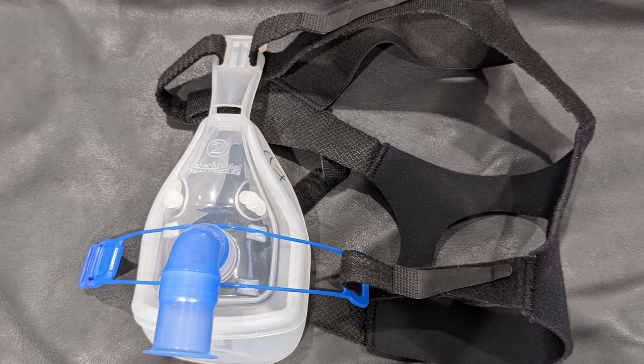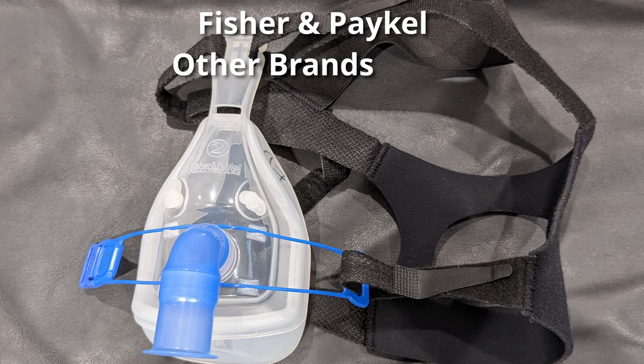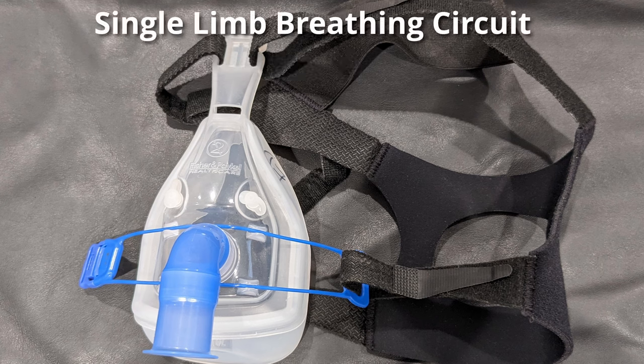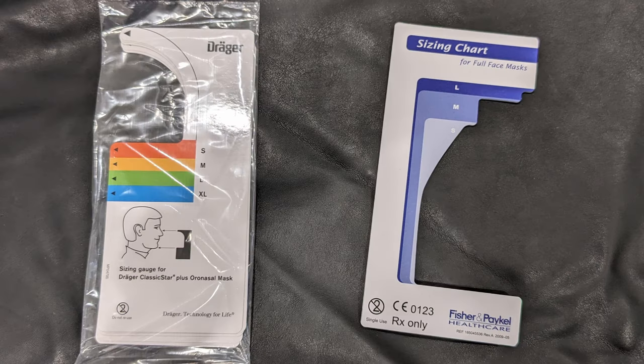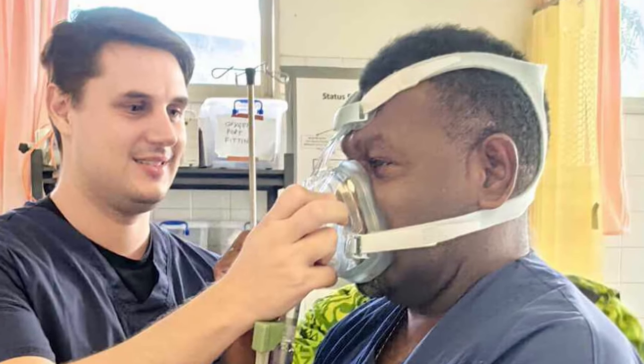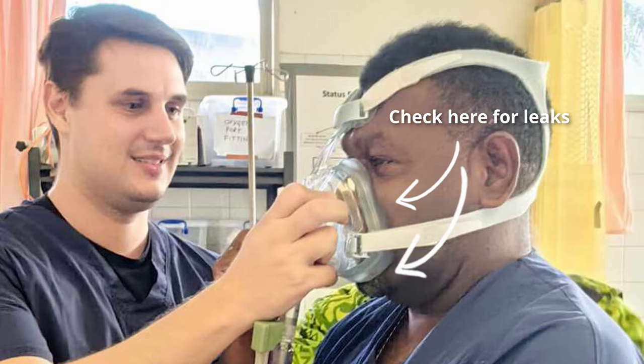For non-invasive ventilation on the OxyLog 3000 Plus, you'll need an appropriately sized non-vented mask for the patient. This is a Fisher & Paykel brand mask, but there are lots of different brands. A non-vented mask is a mask that's designed to work with a single-limb breathing circuit, like the one that the OxyLog 3000 uses, as opposed to the double-limb circuit that some ICU ventilators have. They'll generally have blue connectors on them, and some brands even come with sizing tools to ensure that you get the correct fit. Regardless of the brand, you need to make sure that the mask fits over the patient's nose and mouth and doesn't leave any significant gaps where gas can escape, which makes the ventilation less effective.